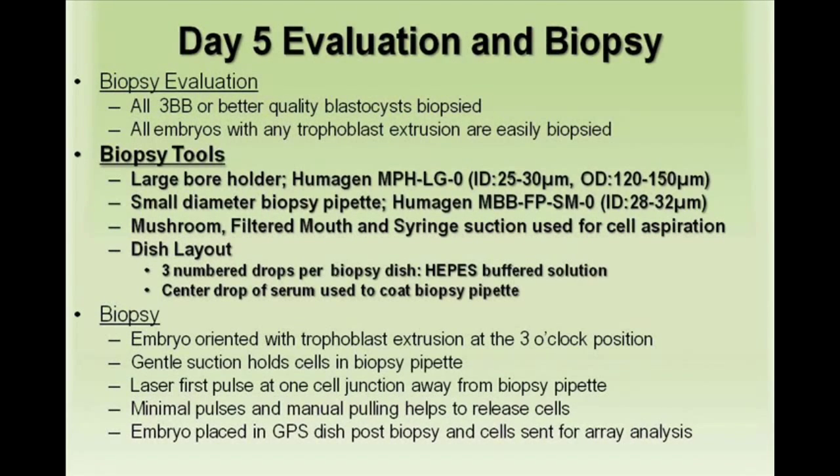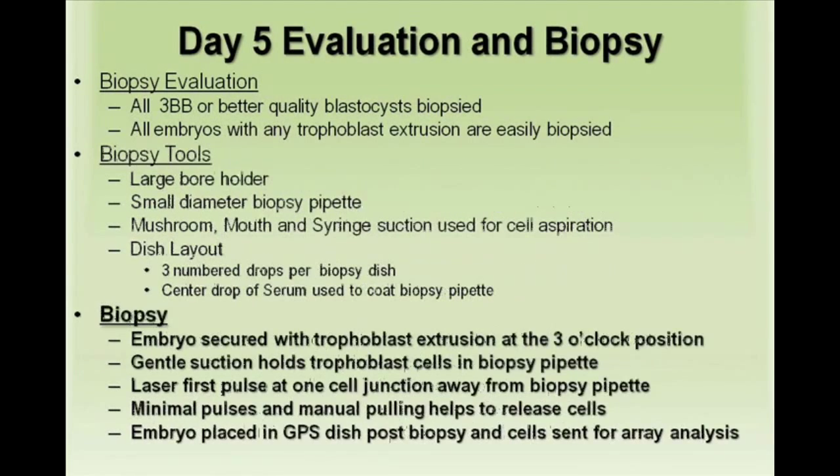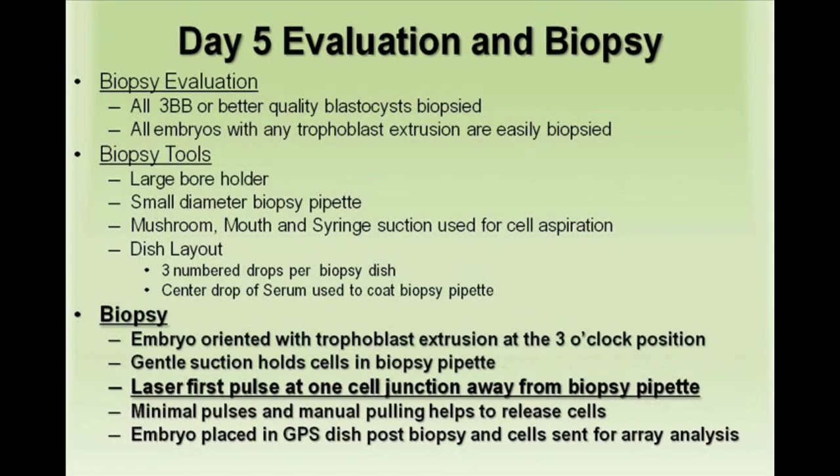We use a large bore holder and small diameter biopsy pipette. At the biopsy, the embryo is secured with the trophoblast extrusion at the 3 o'clock position. Gentle suction then holds the trophoblast cells inside the biopsy pipette. The first laser pulse is at one cell junction away from the biopsy pipette, with minimal pulses recommended.